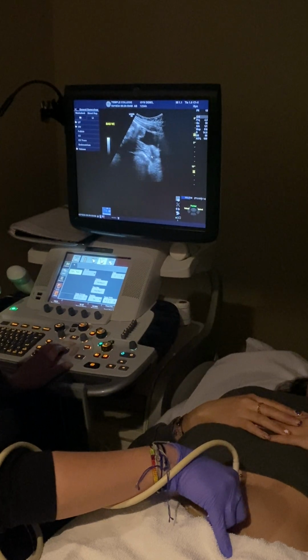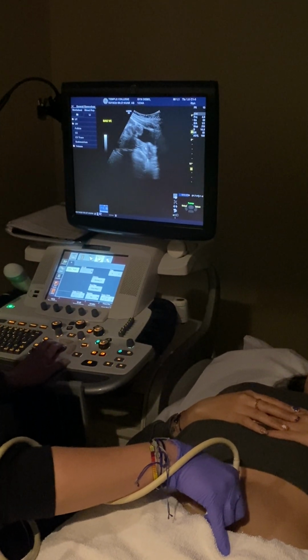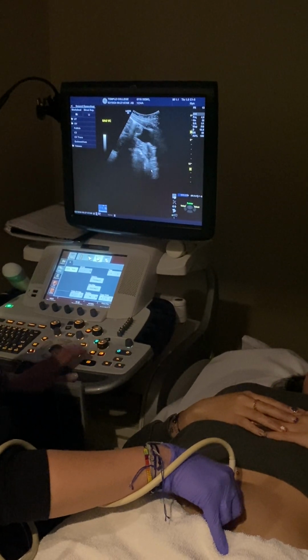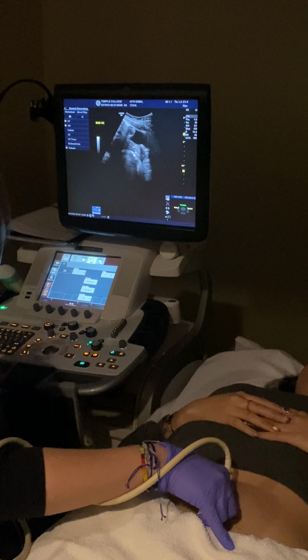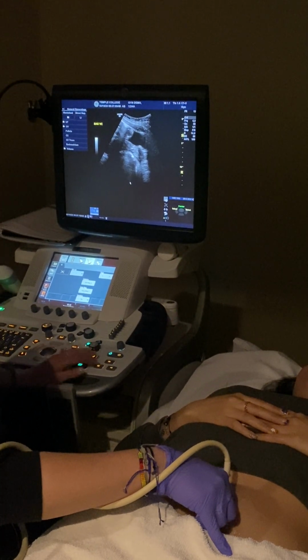So you're going to see probably a hyperechoic line or a hypoechoic canal there. That's going to be your canal. Just lengthen it out as best you can. So you guys see the kind of bright white little stripe down the middle here? Okay, that's going to be part of knowing you're straight with it. You want to see that line going right down there.